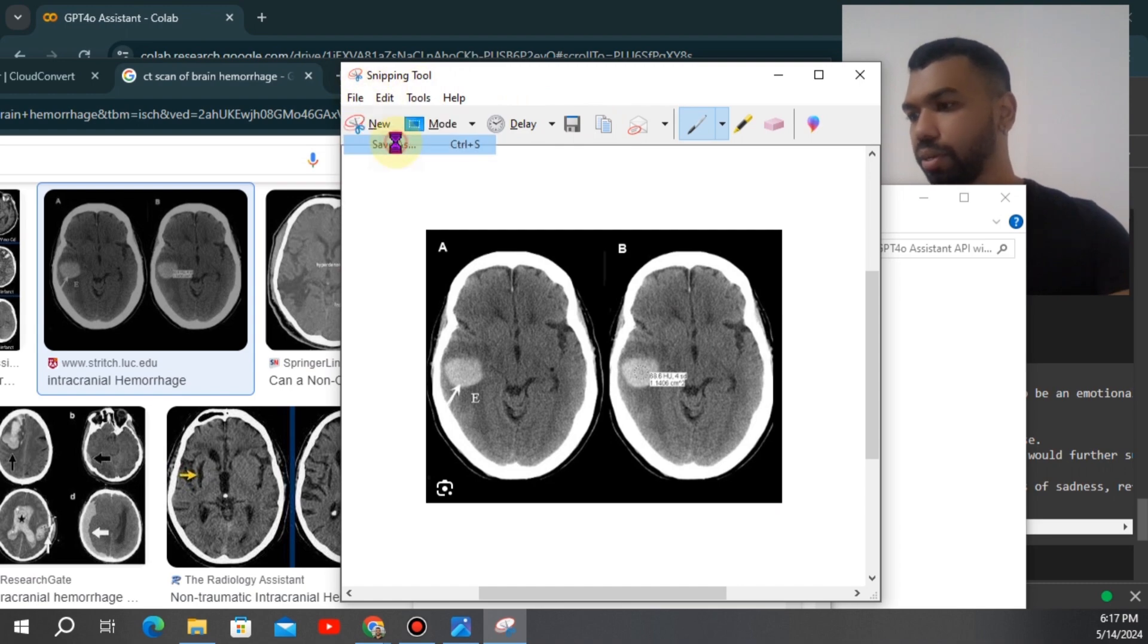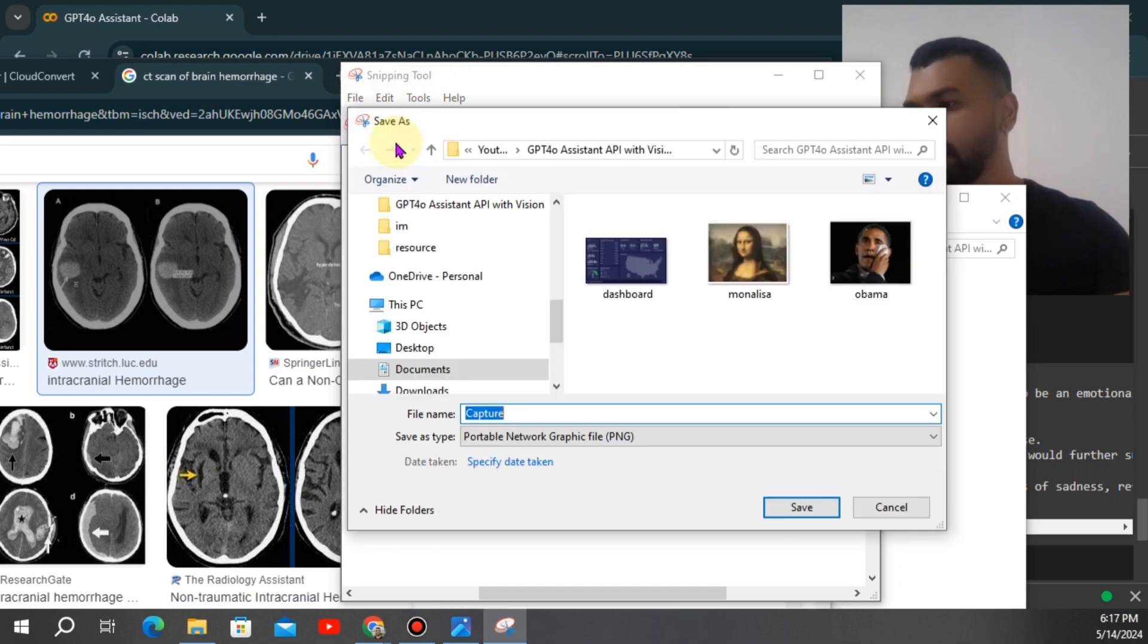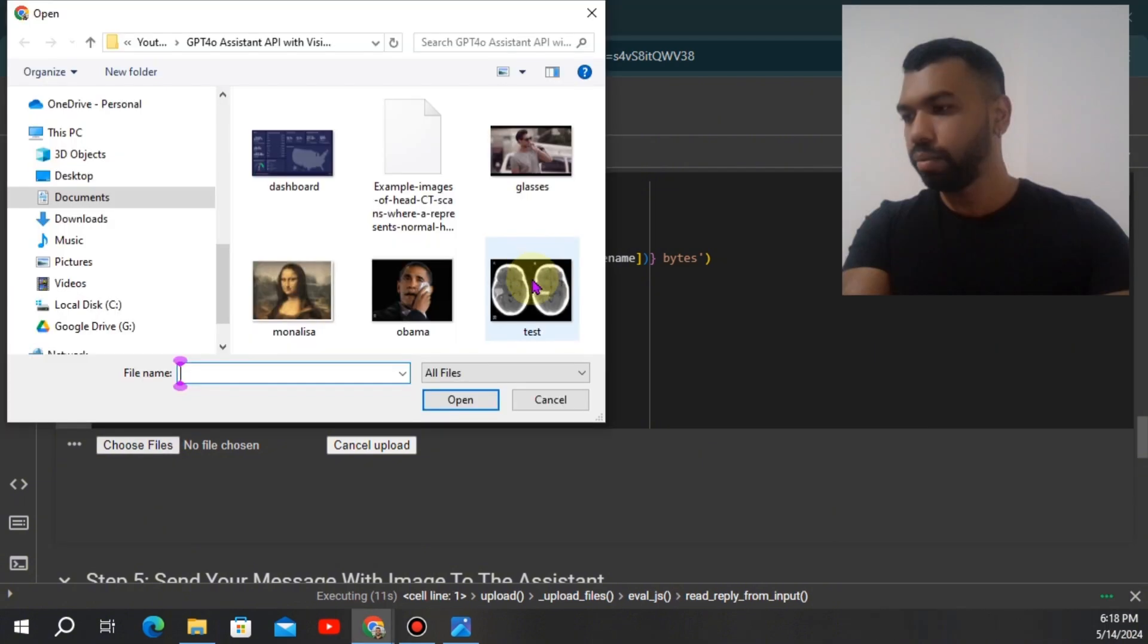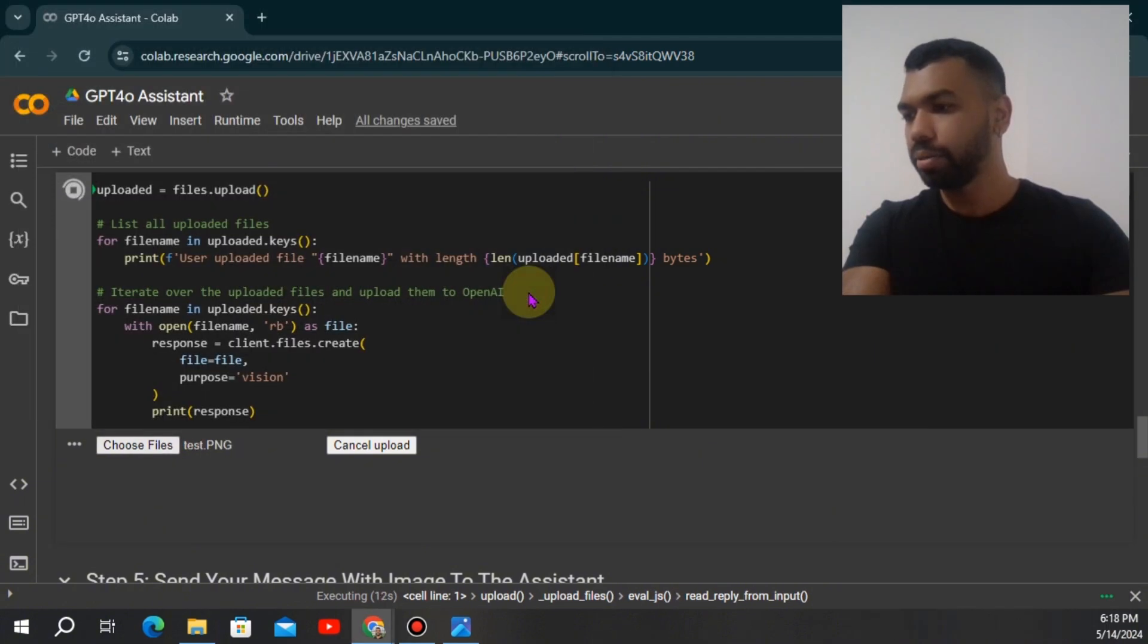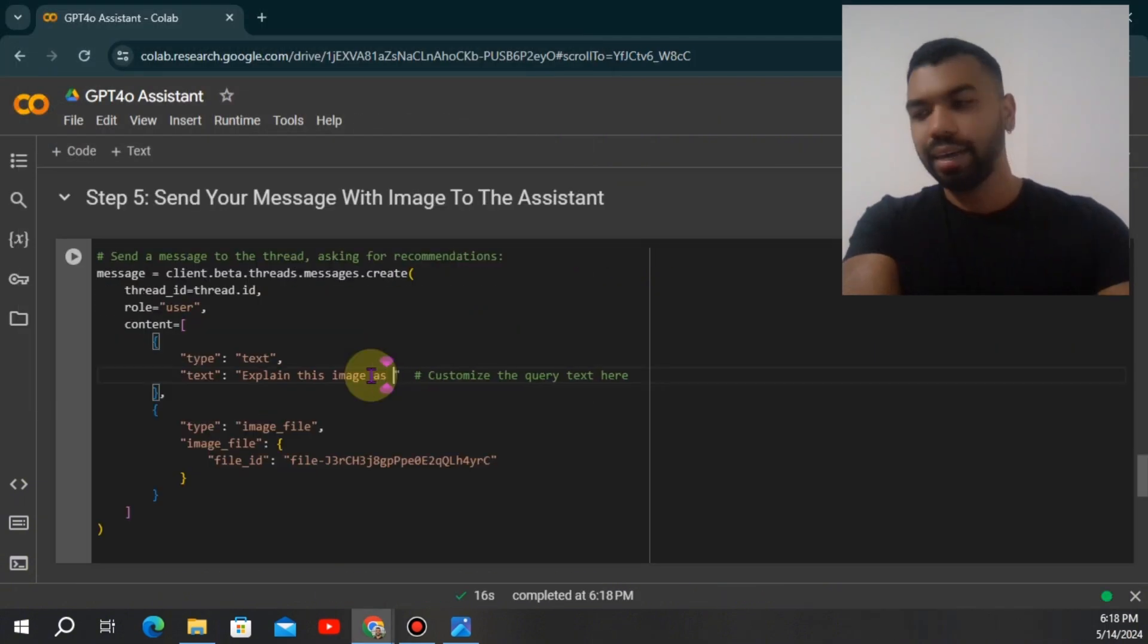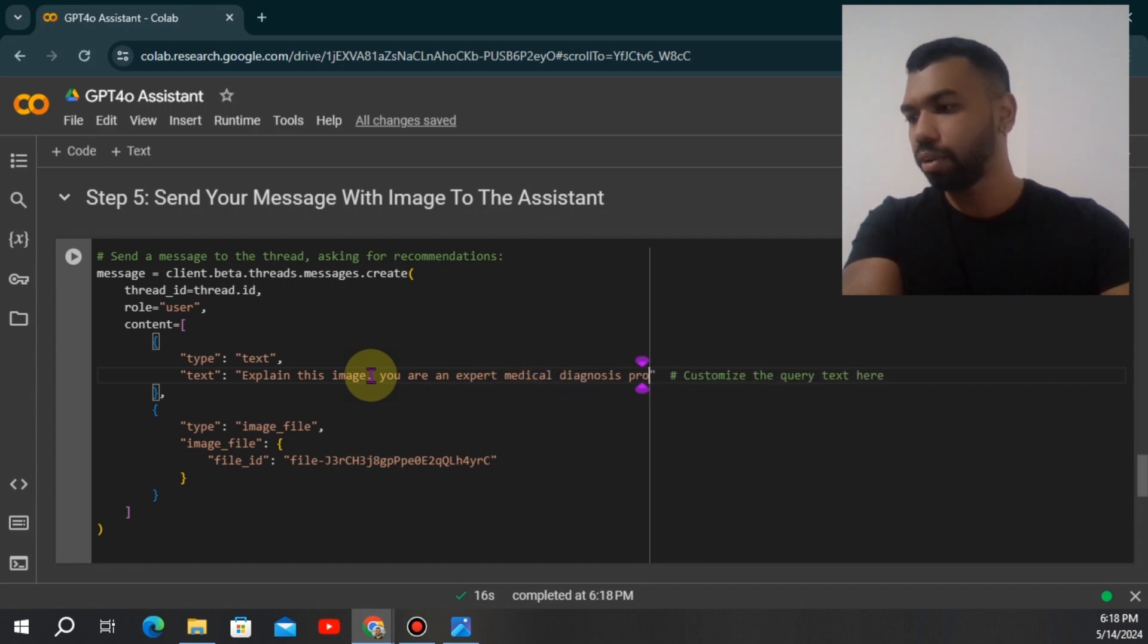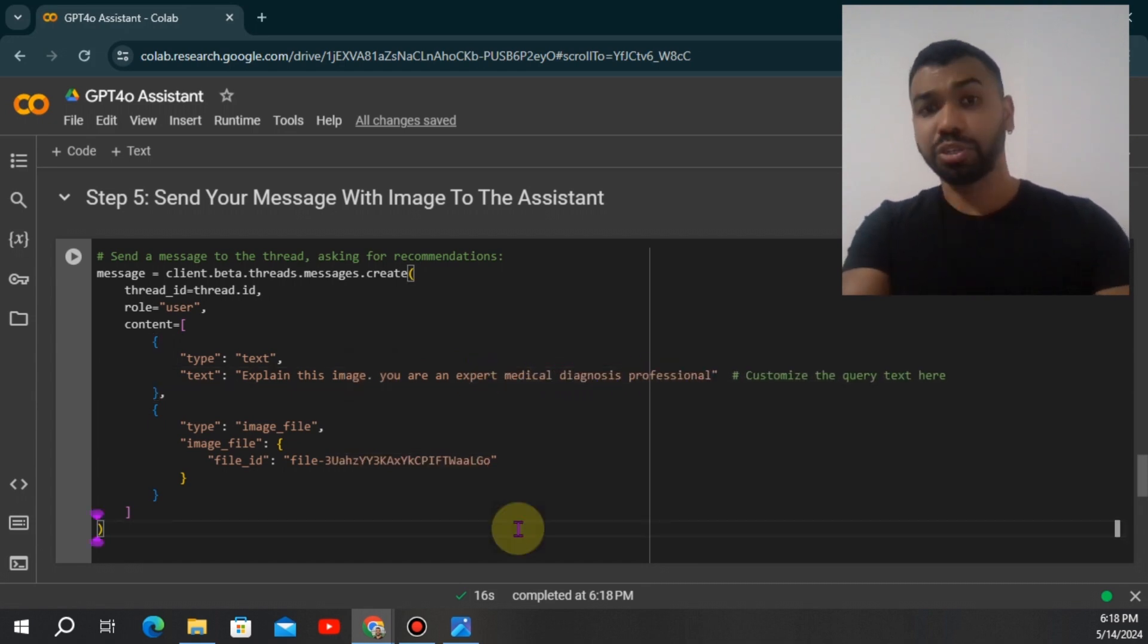We'll go ahead and upload the file as you are an expert medical diagnosis professional and make sure we're using the same file.